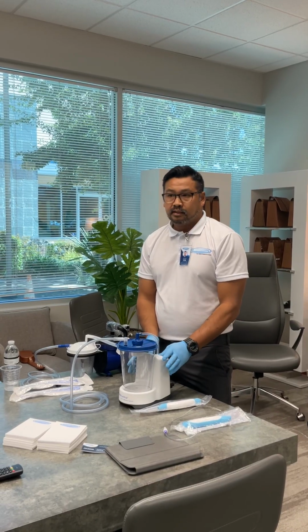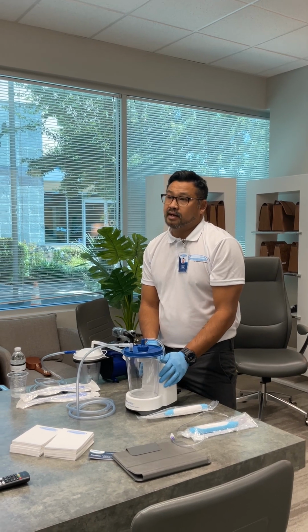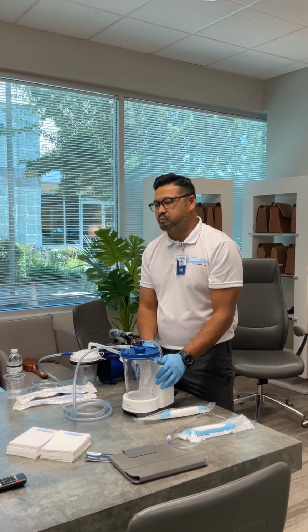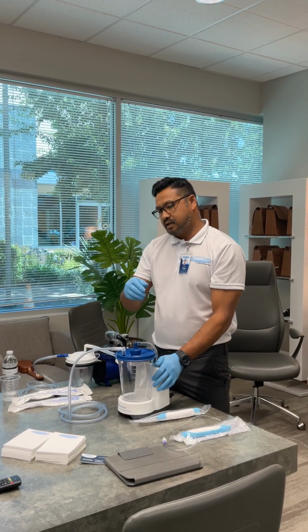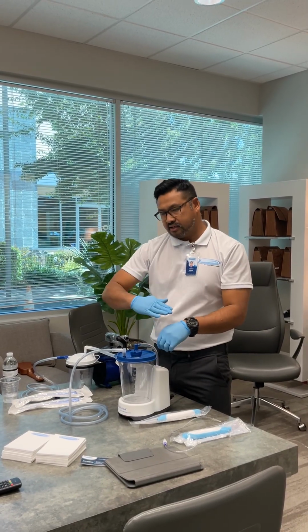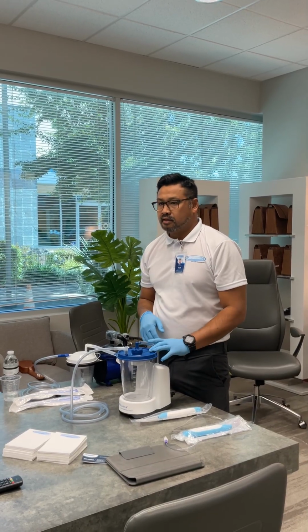Okay. For males, will they need to be shaved? Is it like a sticky? Yeah, it is. Probably best to shave so that it adheres and doesn't fall off. It's like you peel this strip and then it folds on top of that area, and then the penis would insert into it. Do you have a picture of that? I've never seen that.